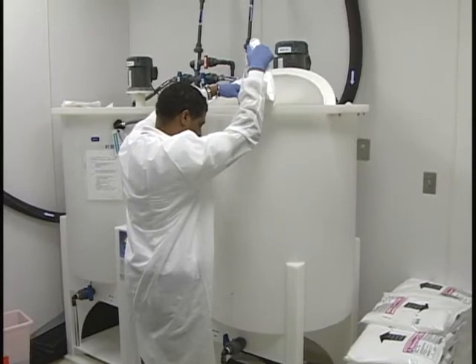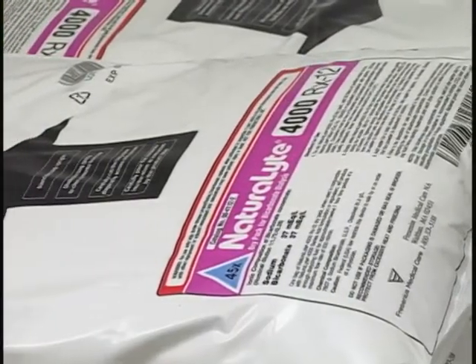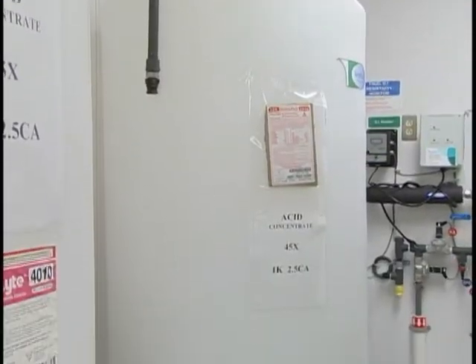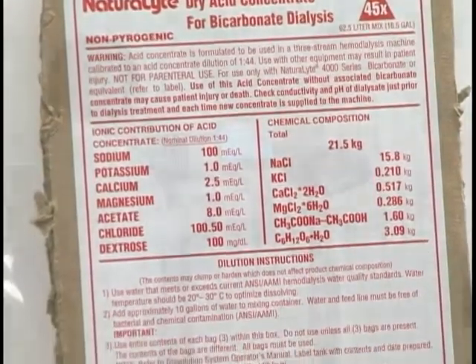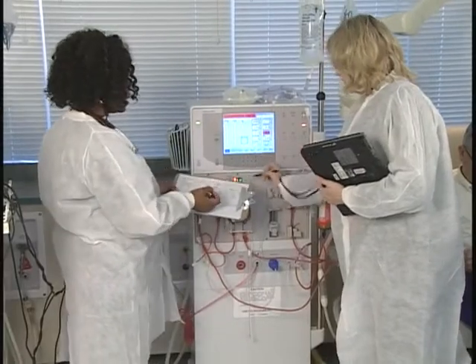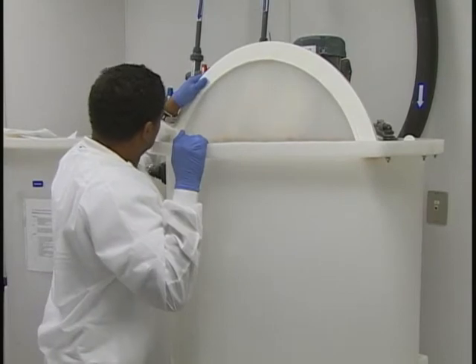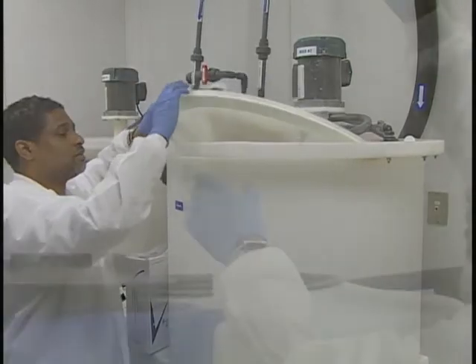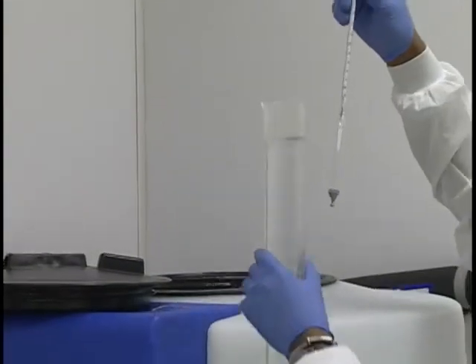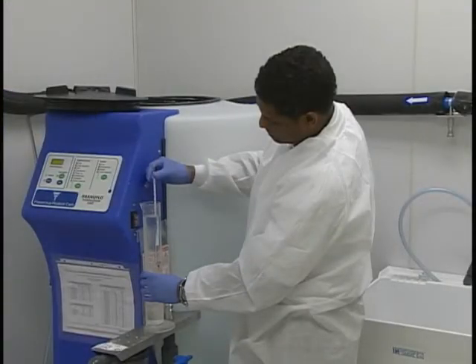Dialysate is customarily prepared from 2 concentrates: the bicarbonate concentrate, which contains sodium bicarbonate, and the acid concentrate, which contains all electrolytes, acetic acid, and sometimes glucose. Serious patient reactions or death can occur if the dialysate is prepared incorrectly or if a mixing machine has malfunctioned. One question you might choose to ask the technician is, what tests are done to ensure that the proper concentration of acid or bicarbonate is achieved?